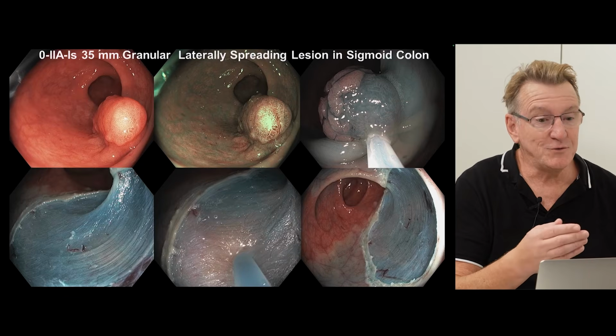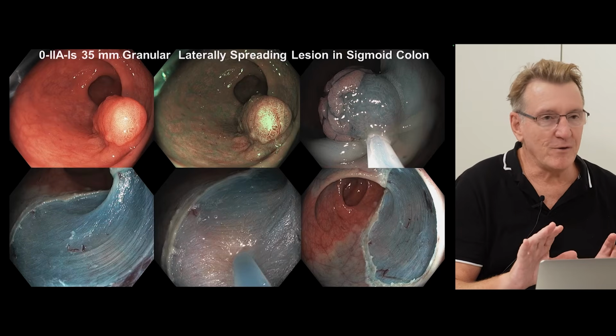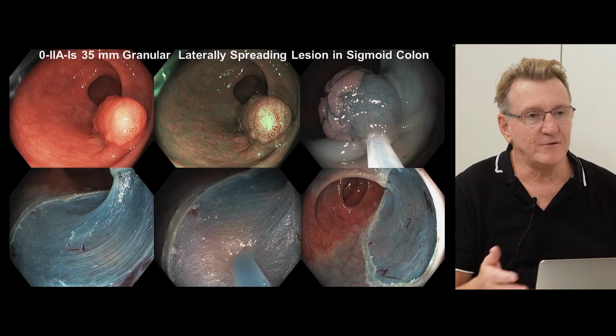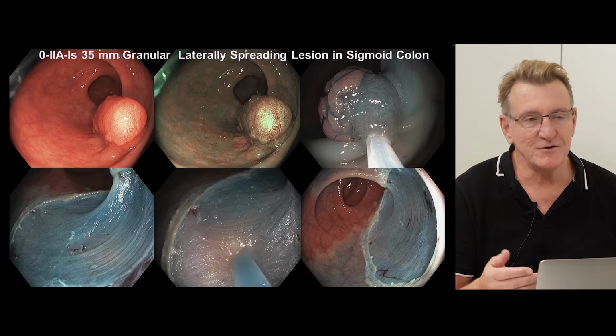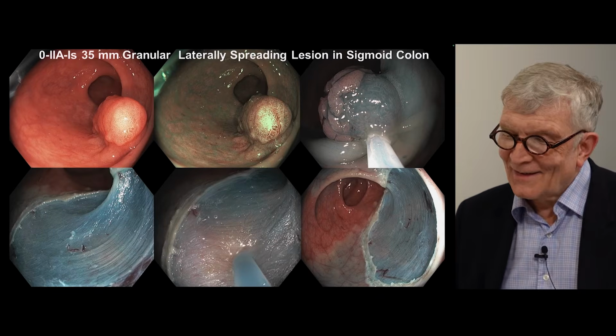And in the old days too, when we made a little hole, we'd sort of, because we didn't have reliable tissue closure. And now tissue closure is at a level that we deliberately make holes all the time and close them up without, I mean, the nurses are still talking about their weekend. No one even notices what's gone on.